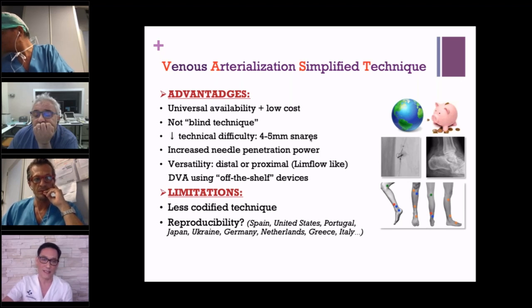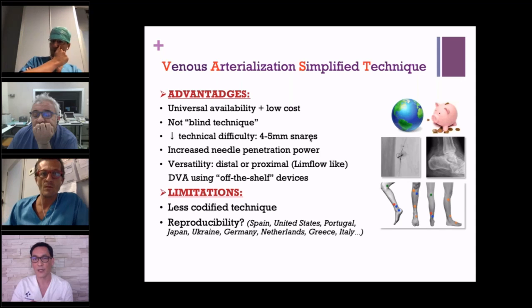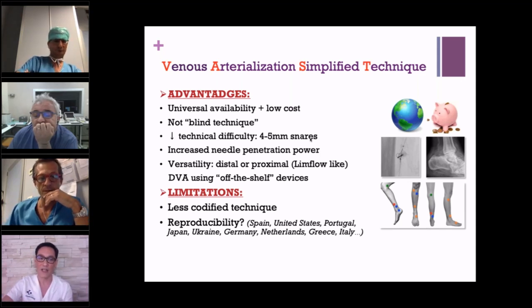So the key point with this technique is that you can perform either a distal DVA or a proximal LimFlow-like DVA using really basic off-the-shelf devices. Obviously, this is a less codified technique compared with the one described by Bruno or the LimFlow device, and we still don't have big data with regards to reproducibility, although we already have amazing feedback from different countries around the world.